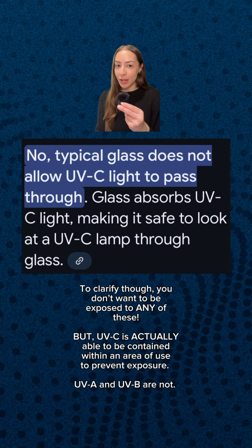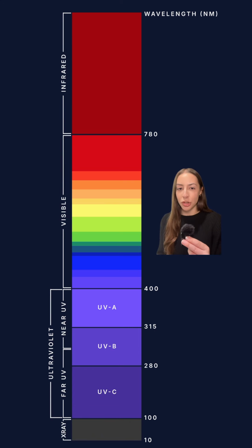Due to its shorter wavelength, UVC at the 254nm wavelength does not have these issues of unpredictable reflection or passing through glass, making it more containable and much safer for controlled environments. Using multiple bands of UV for disinfection will not give you better results. It's less efficacious, it's less consistent, and it's not safe.